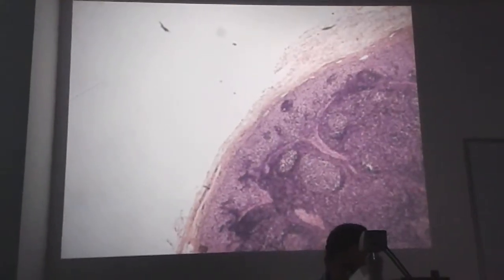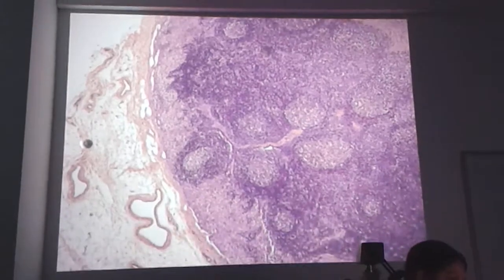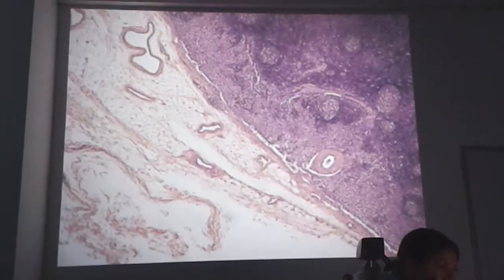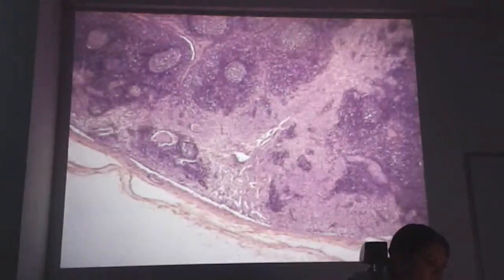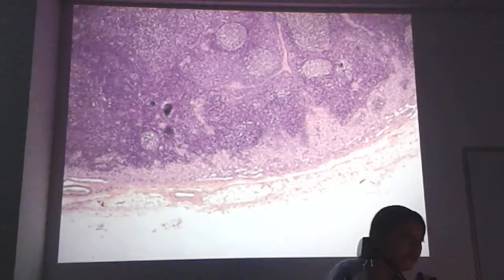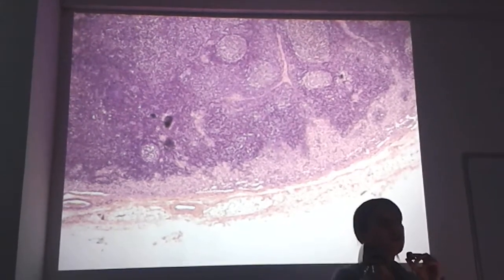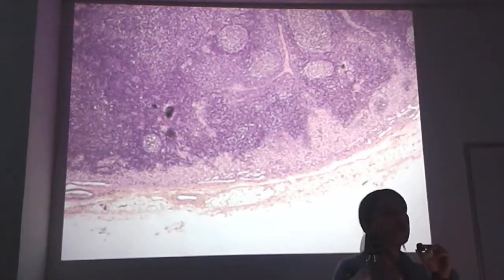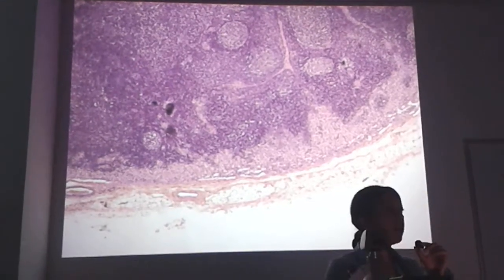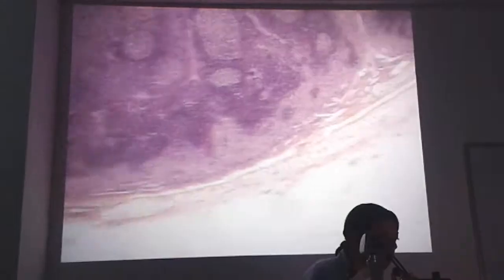The second slide is an example of a lymph node. See, this is the lowest magnification of a lymph node. In the lecture that we've done together, I actually mentioned lymph nodes. We have lymph in our body, which is the extracellular fluid in our tissues, and all this extracellular fluid is collected by lymph vessels. These lymph vessels bring all this lymph to lymph nodes to filter the lymph. So this is our filter, the lymph node. I'm showing you the filter of our body.